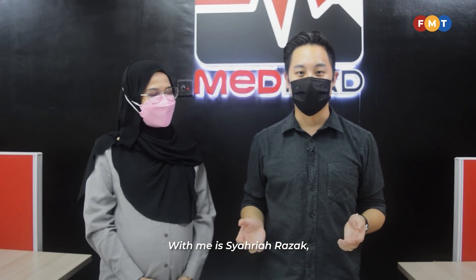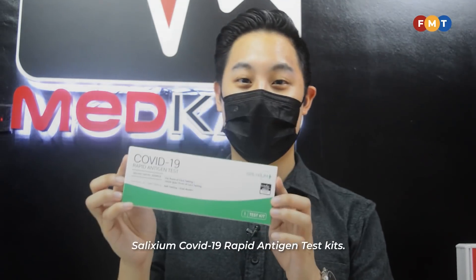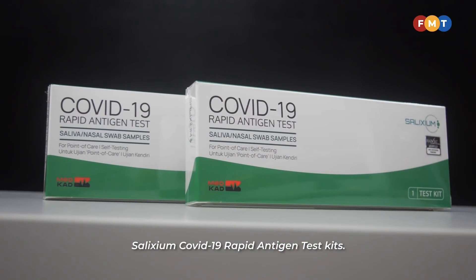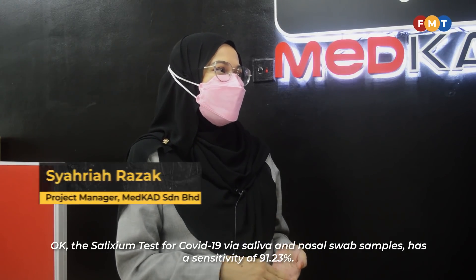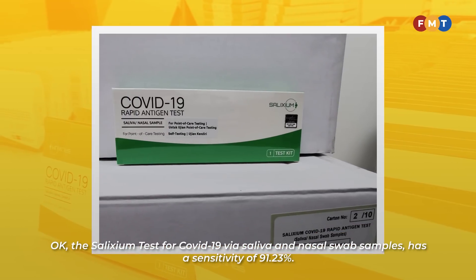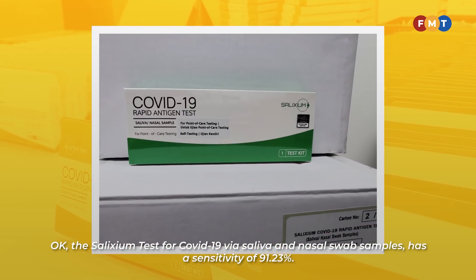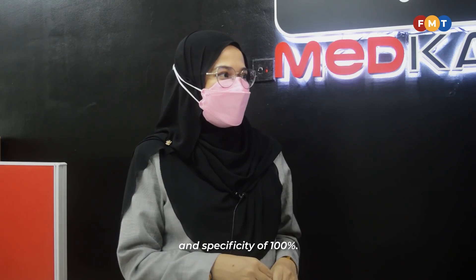With me is Shahriah Raza, Project Manager of MedKad Sdn Bhd, which makes the Salixium COVID-19 Rapid Antigen Test Kit. So Shahriah, tell us how this works. The Salixium test for COVID-19 via saliva and nasal swab samples has a sensitivity of 91.23% and specificity of 100%.